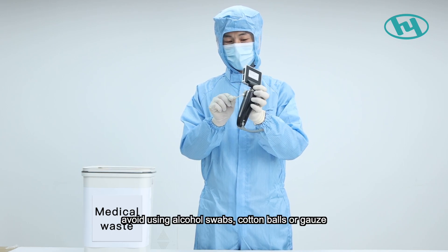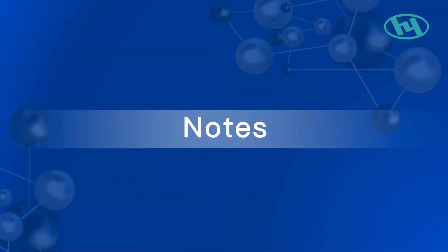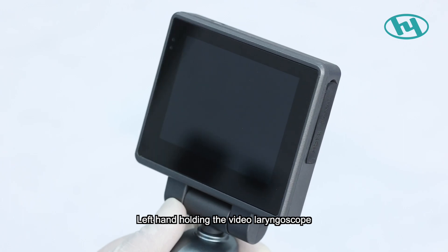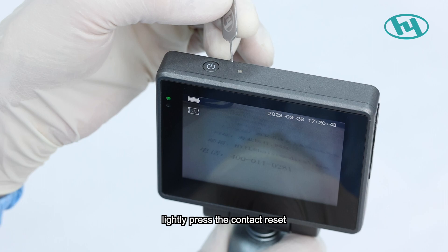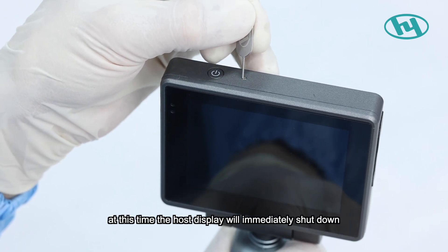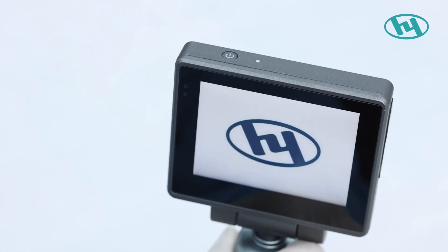Notes — crash handling: Hold the video laryngoscope with the left hand. Use a ring needle or fine needle to lightly press the reset button on the side of the power button. The display will shut down immediately. Then lightly press the power button for one to three seconds to power on normally.